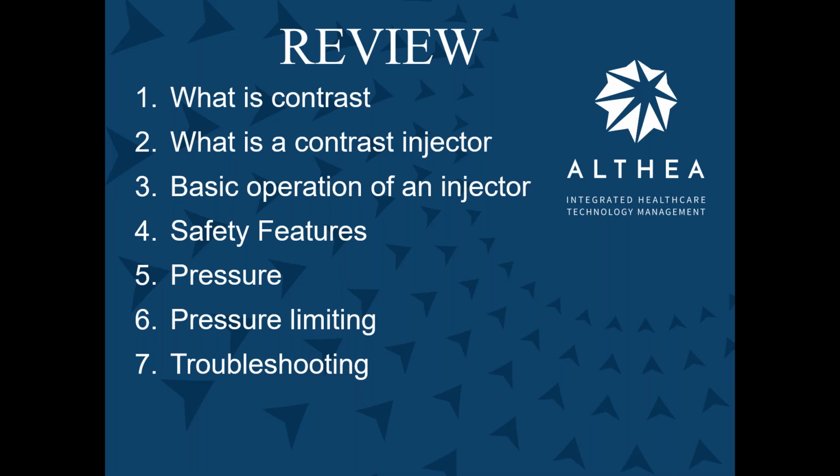Pressure limiting. What is pressure limiting? Reduction of the flow rate to maintain a pressure below max pressure. And troubleshooting. What works, what doesn't work.